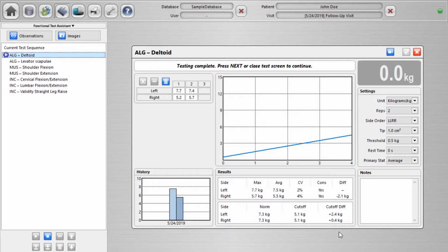And that's the idea of objective data generally: giving you, the clinician, information, actual data points with which to make decisions. Is there something clinically significant here? How does it compare to our previous examinations? Are you making progress based on the treatment plan that we've been following? Those are the kinds of things that you can get from that. So there are other algometry tests here. I'm going to jump down further in the list, and we're going to take a look at some strength assessments as well.